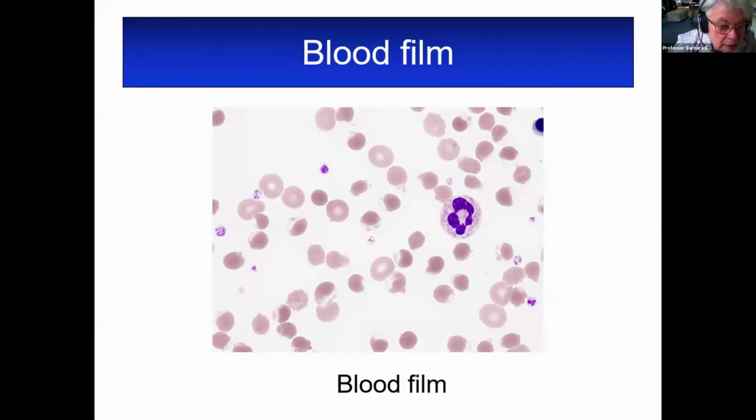And the commonest, I think, in hospital practice is dapsone, and you will often see a few irregularly contracted cells in your dermatology clinic patients who are taking dapsone. So this was obviously an acute onset, and we suspect a G6PD deficiency. But the problem with that was that this was a female, and this seemed a bit severe for a female.